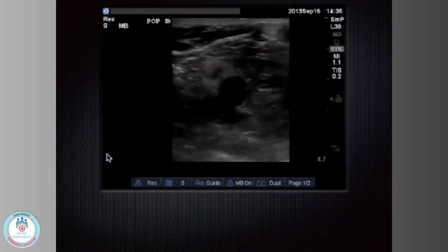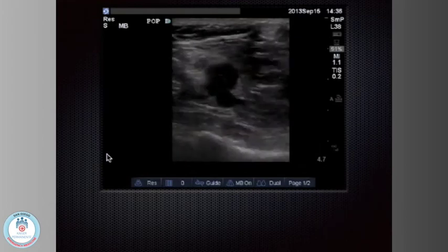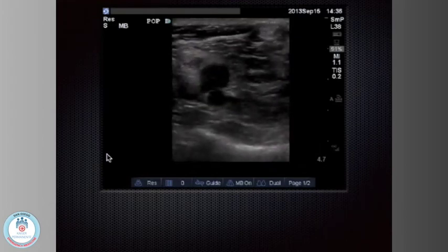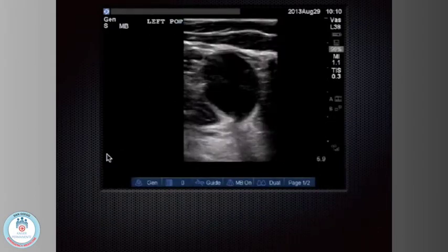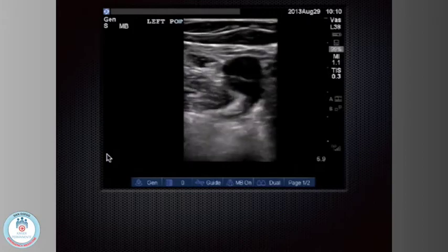Yeah. What vessel? Popliteal, like it says on the screen. Very good. You always want to look around the whole screen. I like that. Absolutely. Yeah, you're doing a good job with these guys. So it's non-compressible, and I get back in that popliteal.